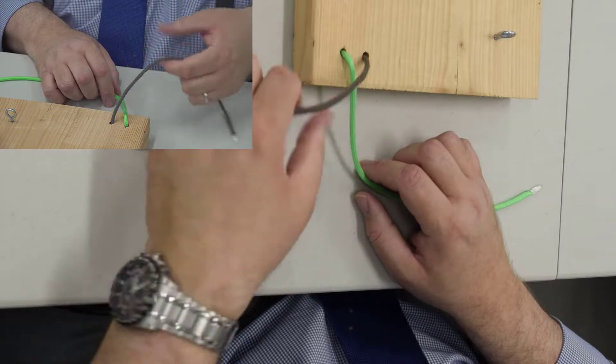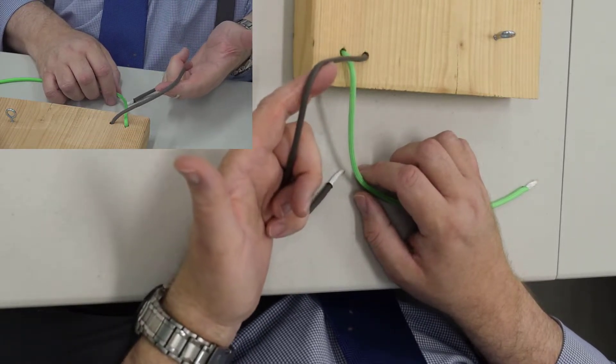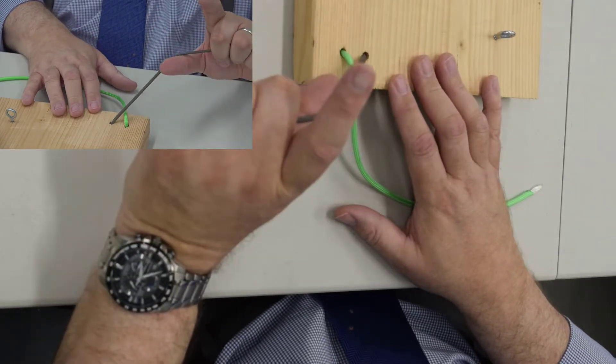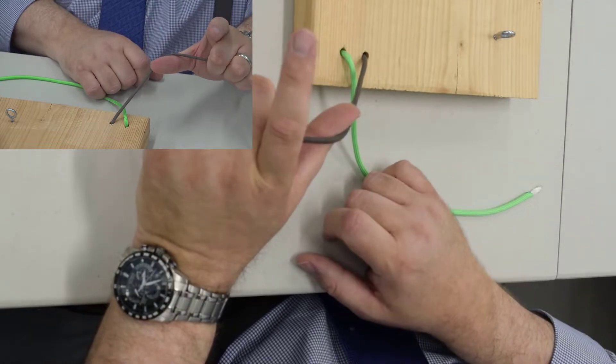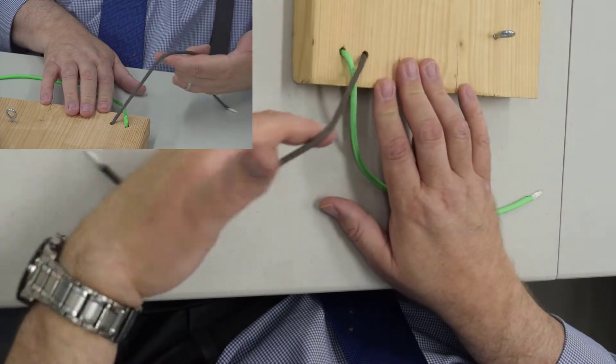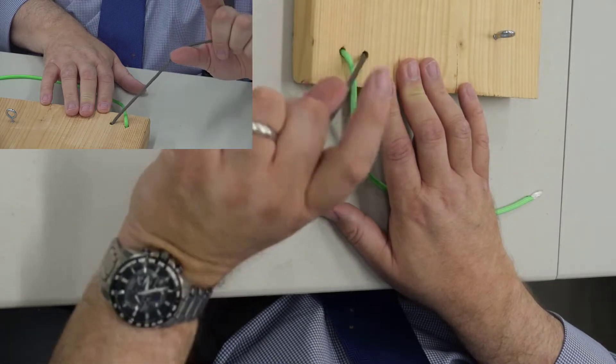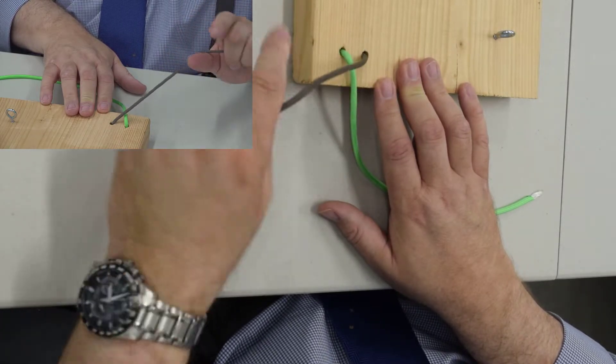So the two-handed tie only requires, and I use my left hand for this, only requires that you make a gun and then flip your wrist. So the thumb takes this position. So it's going to be gun, thumb. You should do it exactly like I'm showing you here.